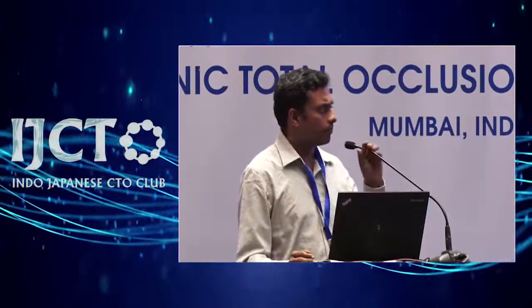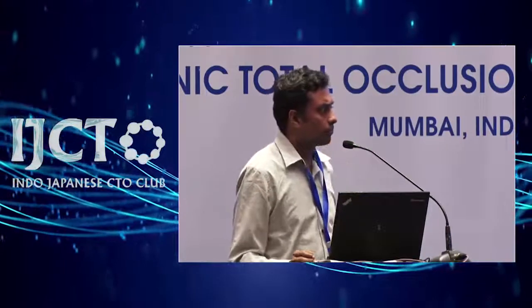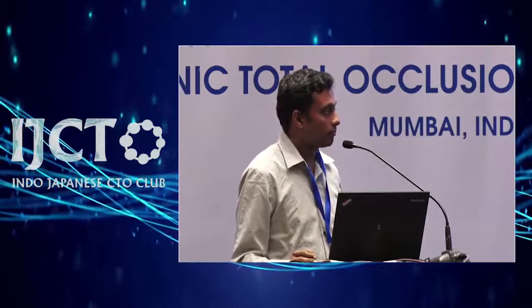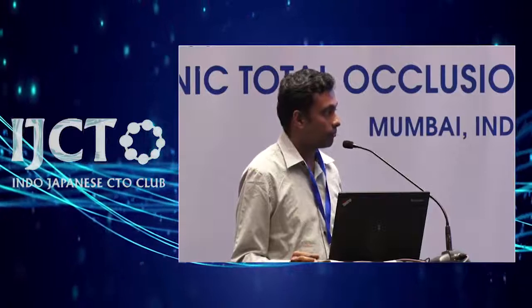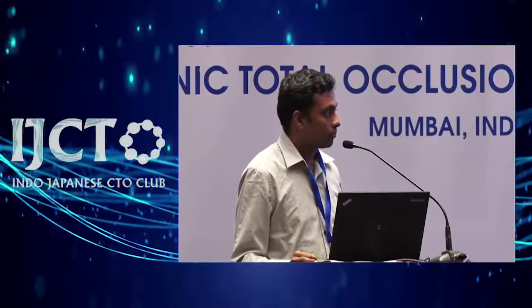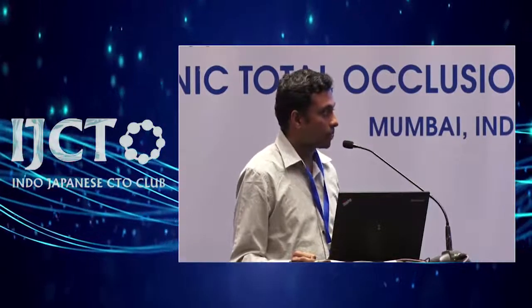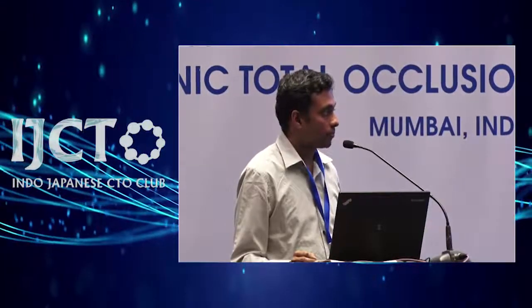What do you think, Dr. Balvi? Yeah, it's perfect and a very comprehensive lecture. The question is that IVUS is such an important tool that it is being underutilized, and without really understanding where you are, it becomes very difficult. You keep trying in one direction and you may be completely out of the way. So IVUS makes life actually easier than what we think. We don't use it because of the time it takes, but it actually reduces the contrast and the time of the procedure. So IVUS is a very, very important tool in such a situation.